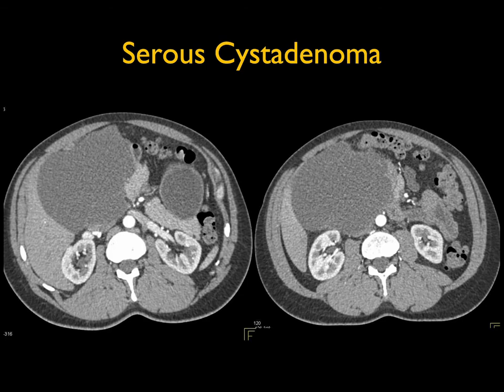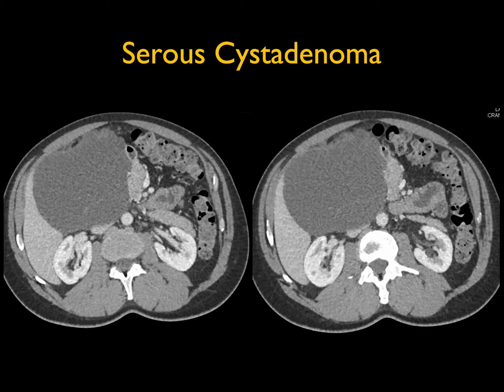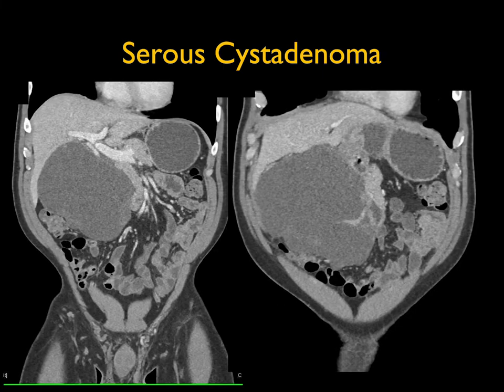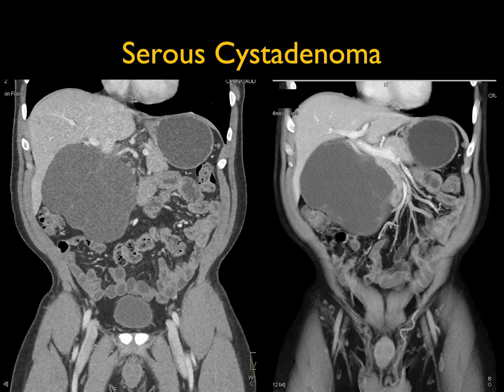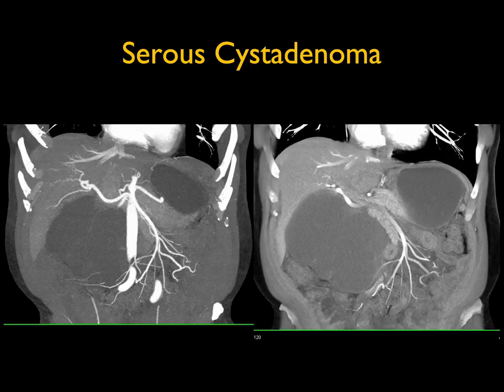Serous cystadenomas occur in patients around age 65; MCNs typically around age 45. Serous cystadenomas have a range of appearances — they can have septations, a Swiss cheese appearance, or be oligocystic like this case, with displacement of adjacent structures like vessels. They are always benign with no malignant potential and won't bleed, but can be symptomatic due to mass effect, so as they get larger they're often resected. A really nice example of a classic serous cystadenoma displacing vessels on the arterial mapping.